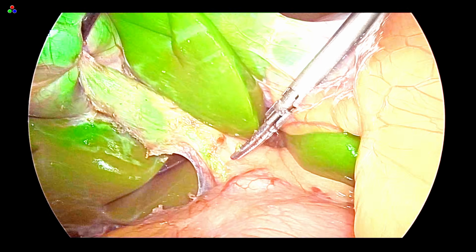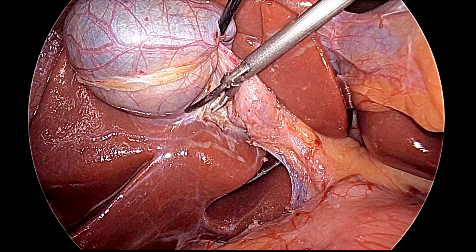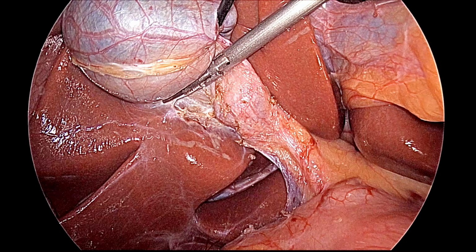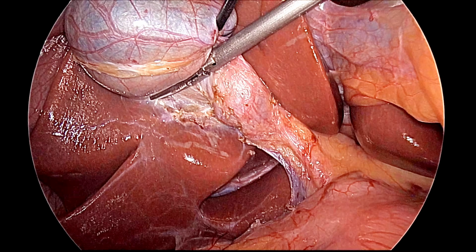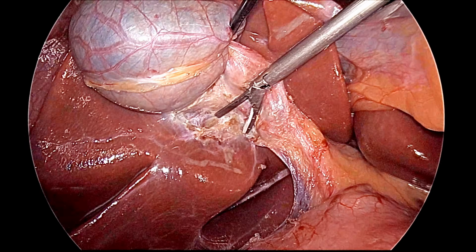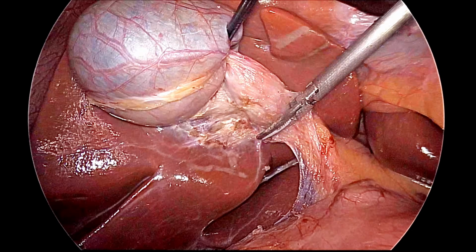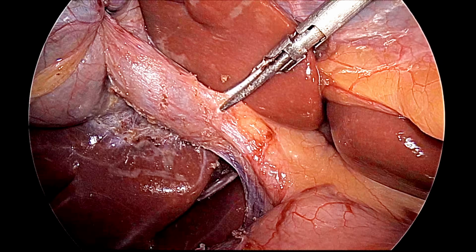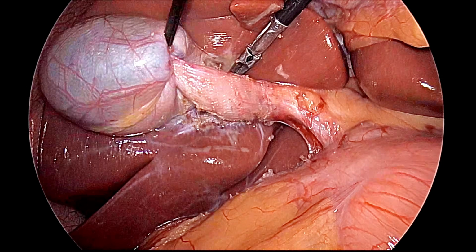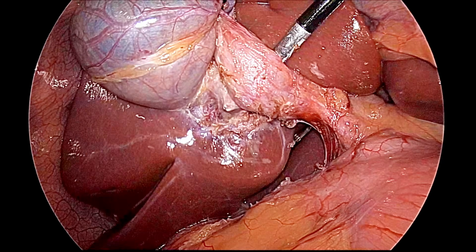We can put the ICG on, you can see this is the CBD, and this is a very small cystic duct in this patient. So we will do a little more dissection of the cystic plate. And up to one-third of the gallbladder the posterior peritoneum is being separated. Now, this is the artery below, we will take a Maryland and confirm the posterior window by opening the jaw of the Maryland, and the inferior surface of the liver should be clearly visible.